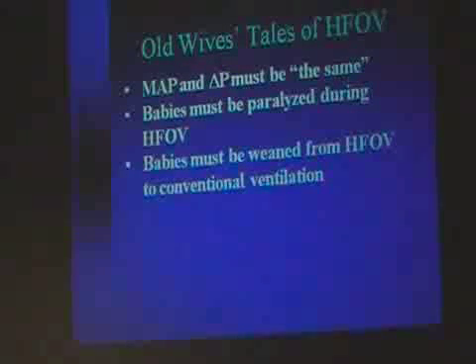Now, the whole point about whether the active exhalation can cause, at some points in the lung, a narrowing of the airway and cause what's called a choke point, where gas has more trouble getting through. This was theorized by some people, never been proven, never been shown, and really to me doesn't make any sense because you've got the dilation of the mean airway pressure holding the airway open. But you will hear some people in the area talk about that as a possibility. It's never been shown, I've never seen anything on it, and neither has anyone else.